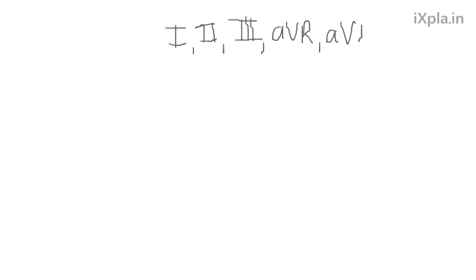In this video, I'll just review a lot of things that we've said and do a quick review. A quick review of things you definitely want to know is, of course, all the leads: lead 1, lead 2, lead 3, AVR, AVL, AVF. You want to know what they equal, but more importantly, the angles are important to know.